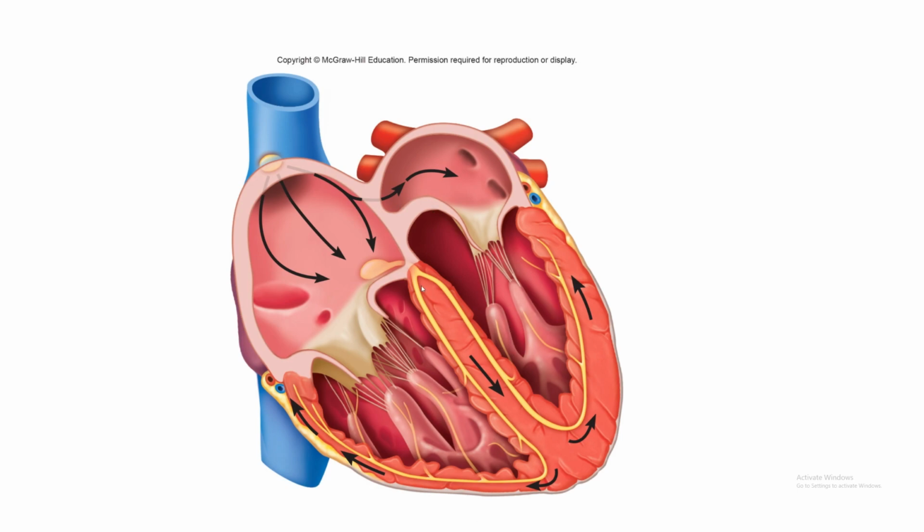And then all of this tissue is going to repolarize. What repolarization essentially means is that cardiac tissue is going to become more negative, and it's going to go back towards what's called its resting membrane potential, which is inherently negative. Resting membrane potential is about negative 70 millivolts. So it's going to start becoming more negative again, right? And once it repolarizes, ventricular repolarization is going to create what's called the T wave on your EKG strip. It's going to be another upward deflection.